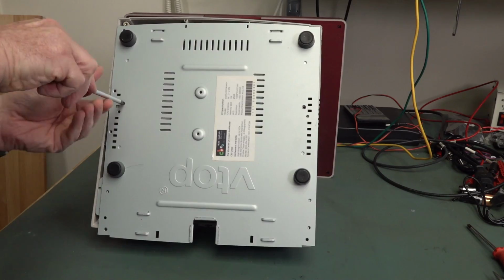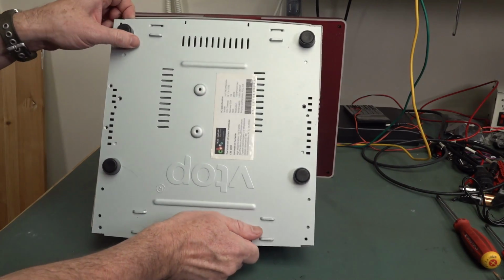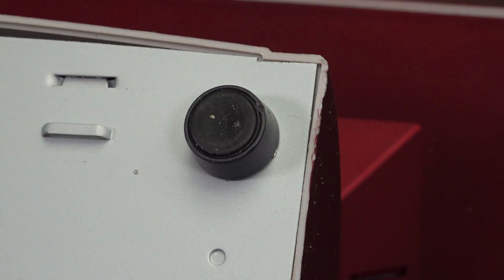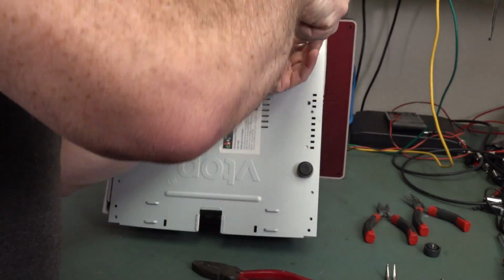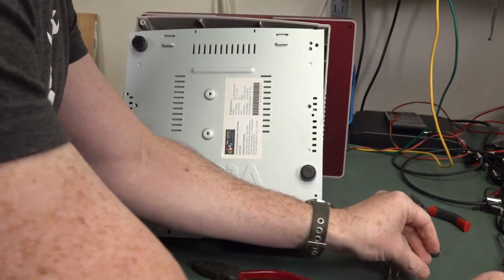Countersunk. Flathead. Countersunk. There's another one. Missed it. That's probably holding the PC in, I'd say, but is there one under the foot? Damn. If you can just see that, there's a little countersunk screw under there. What a mongrel. There's a couple of little mongrels under there. So it could be under the other ones as well, but this should at least allow me to get this thing out.